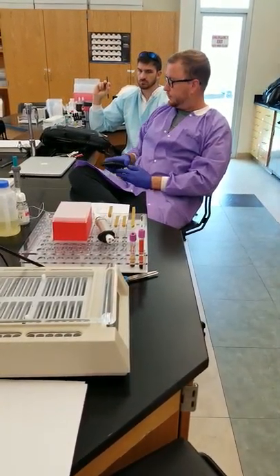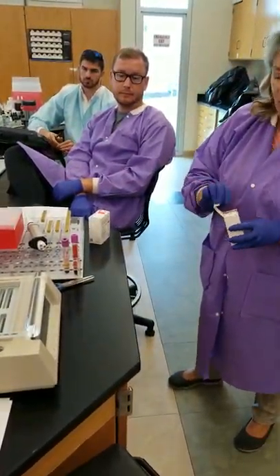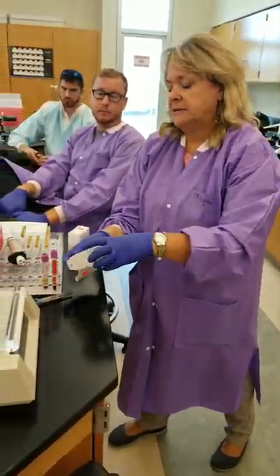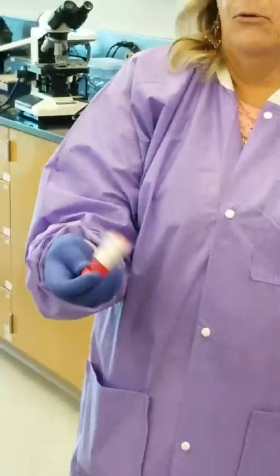We're used to using 3 to 5% cell suspensions for our tube testing. In the gels, we use a 0.8% cell suspension. So basically, these are the same reagents that you're used to seeing. They're A1 cells and B cells, but they're a much weaker concentration because we're going to use them in the gel. Okay, and here again, like anything else, you want to make sure they're already suspended.